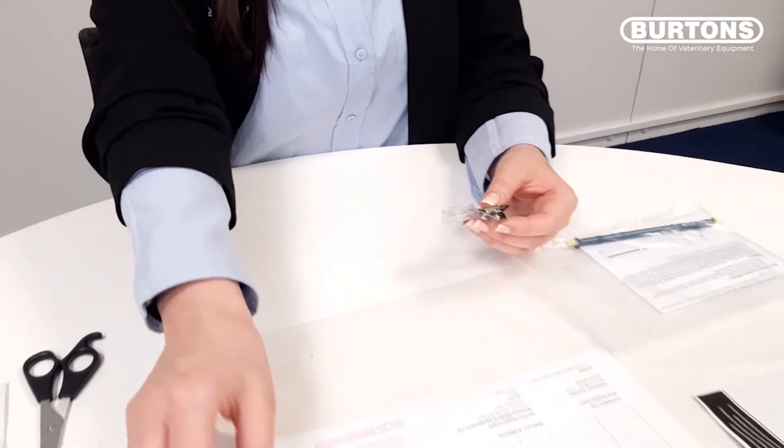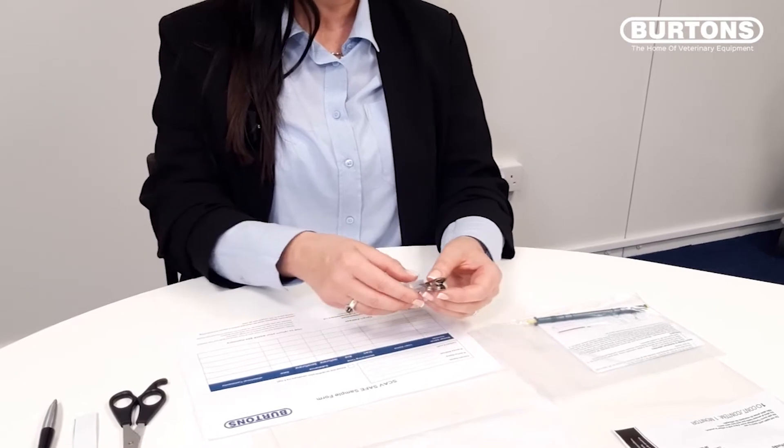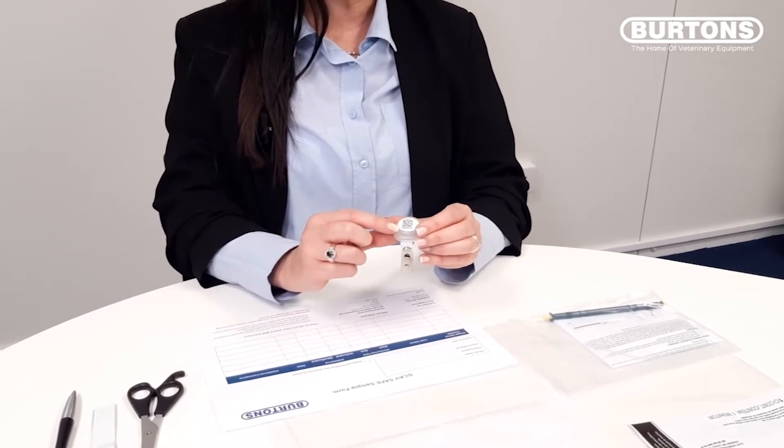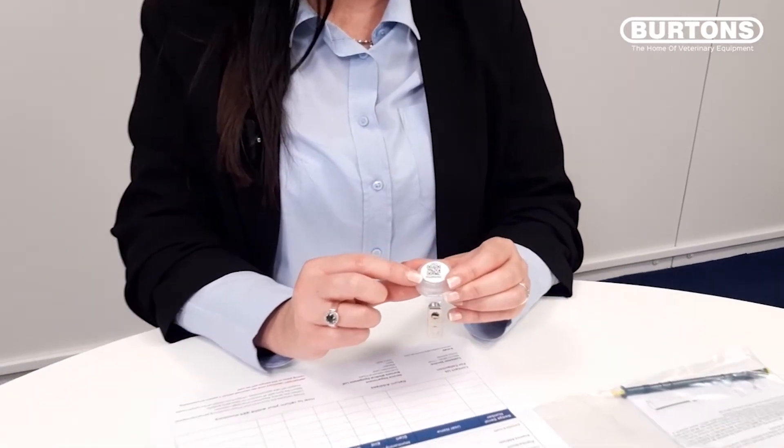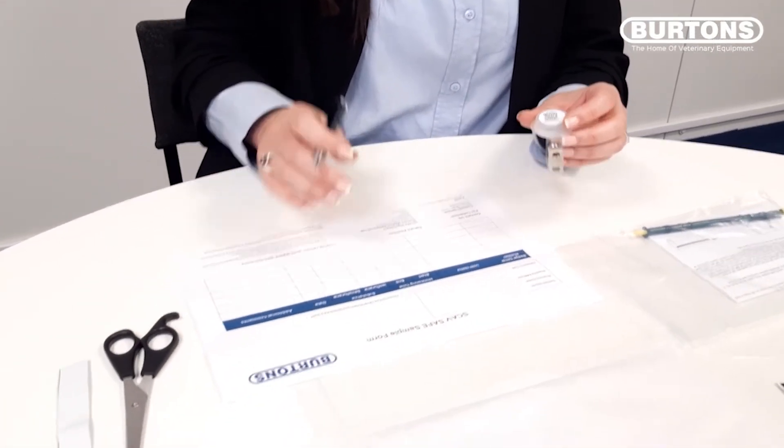You now need to start to complete your sample form. This is the serial number of your badge — enter this on the form.